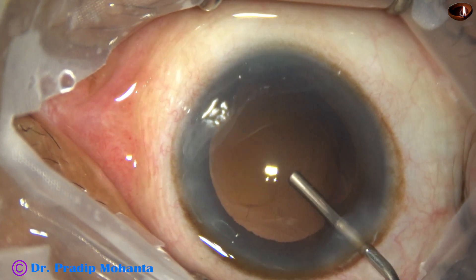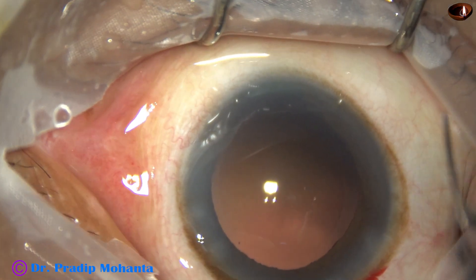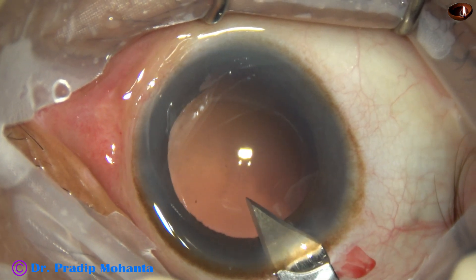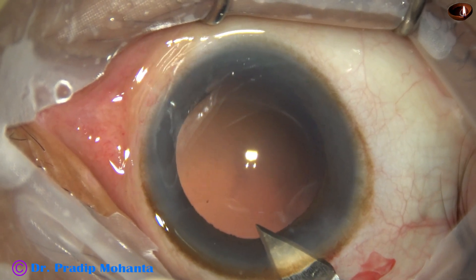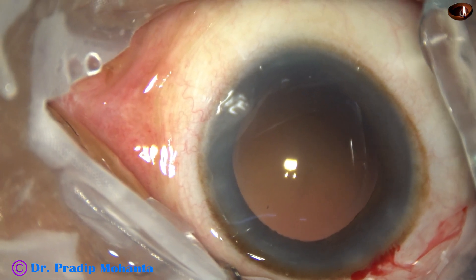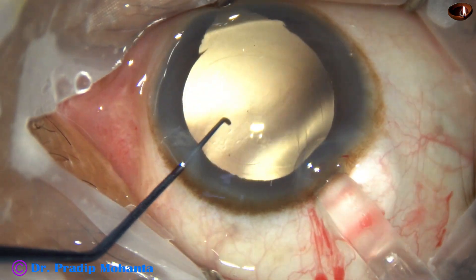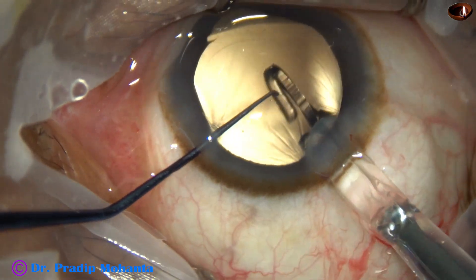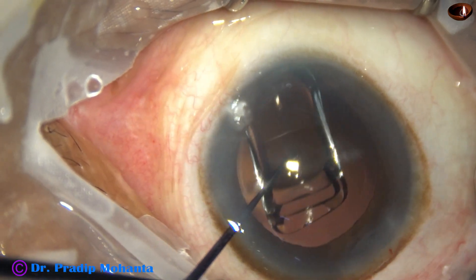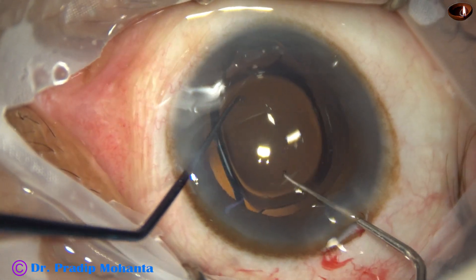Now it is time to implant the intraocular lens. When the zonule is weak, I always implant the lens under viscoelastic because irrigation pressure can cause tearing of zonular fibres. I inject visco to fill up the anterior chamber, then implant the lens — at this time there is no irrigation pressure on the zonule. When the leading haptic is in position, just bend it and place it in the capsular bag; both haptics are in the capsular bag.